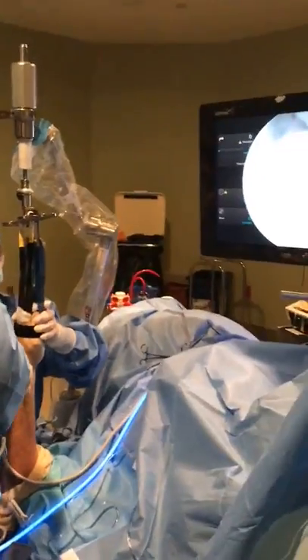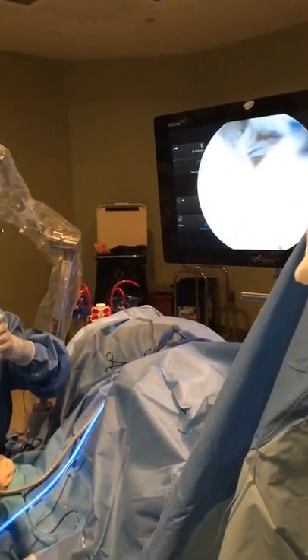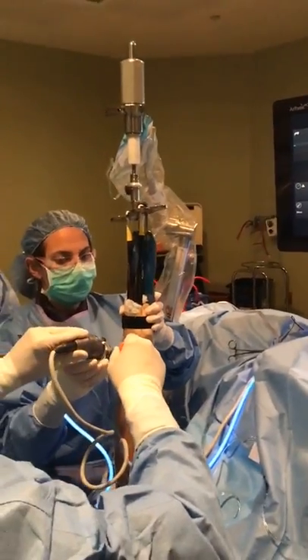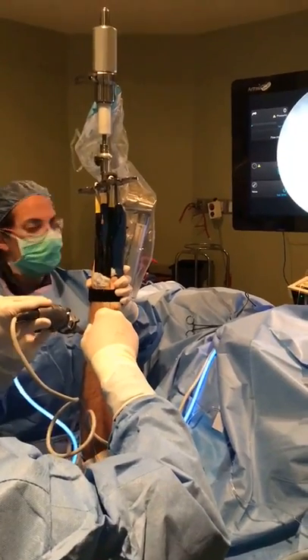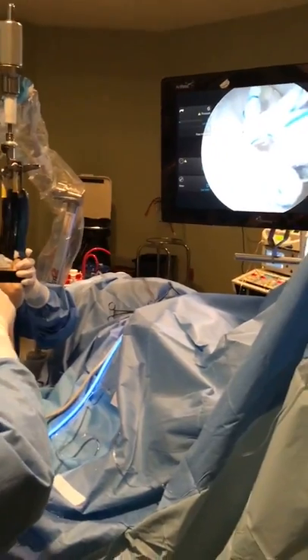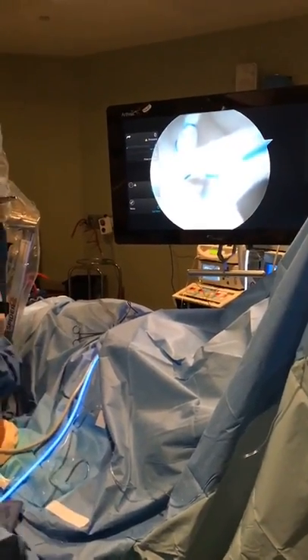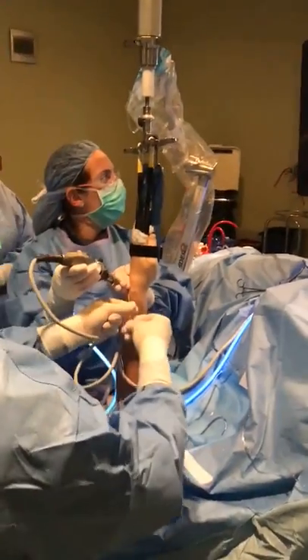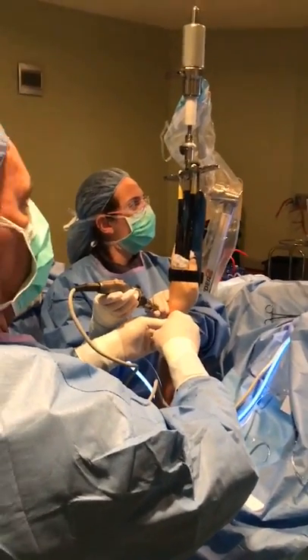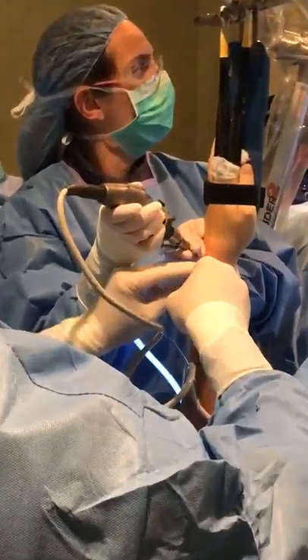Thick edge of the TFCC, so okay. Feel the needle there. Okay, good. Can you take a picture there, Kate? Okay, beautiful. Okay, now we get that device. So now I start pulling on the suture, and you're going to see this is going to cinch it down. Beautiful. Okay, let's get a picture of that.